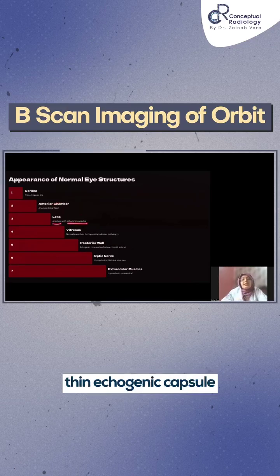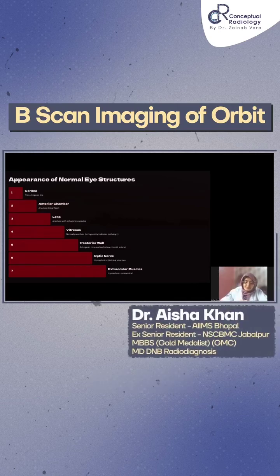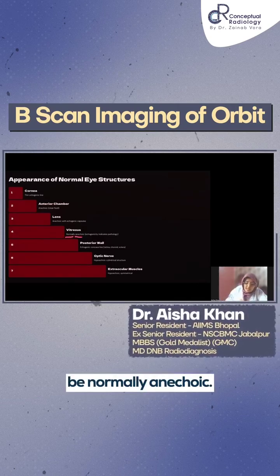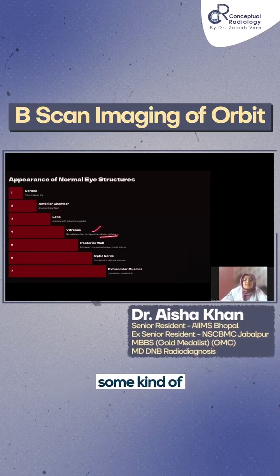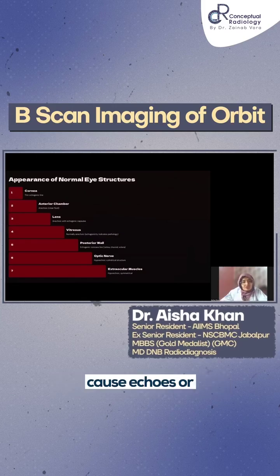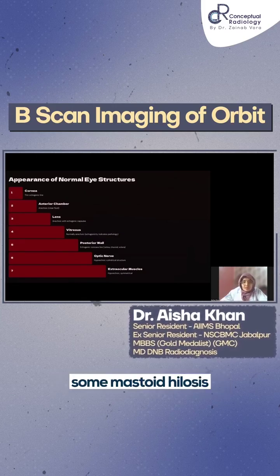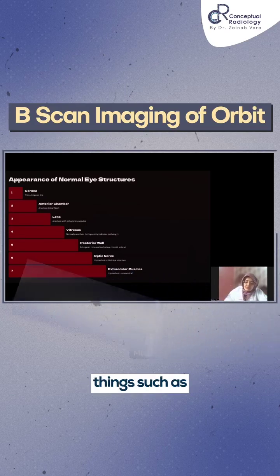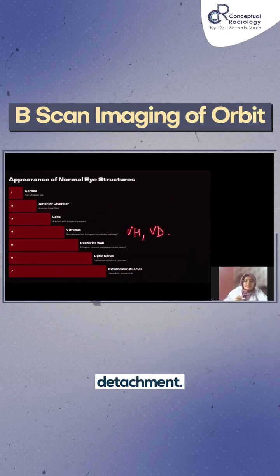The lens should be anechoic with a thin echogenic capsule that is uniform on all sides. The vitreous should also normally be anechoic. Any echogenicity indicates pathology — this can include age-related degeneration, asteroid hyalosis, or more sinister findings such as vitreous hemorrhage or vitreous detachment.